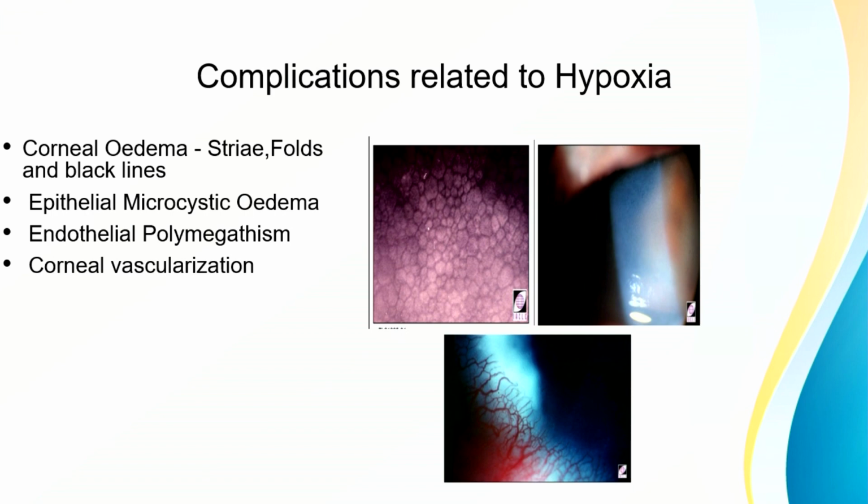Mainly the corneal vascularization, in people who are majorly using yearly lenses, conventional lenses, or patients with high Rx power, like maybe -10, -20, -30, or on the plus side also, wearing it for so long without any break in between, all end up in corneal vascularization and some corneal hypoxic changes also, where they complain of halos after some time, especially in scleral lens wear in post refractive surgeries or post PK or RK, where we give scleral lenses.